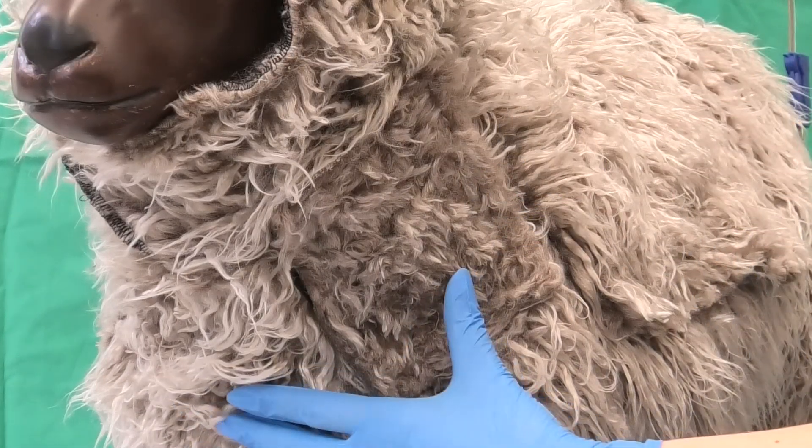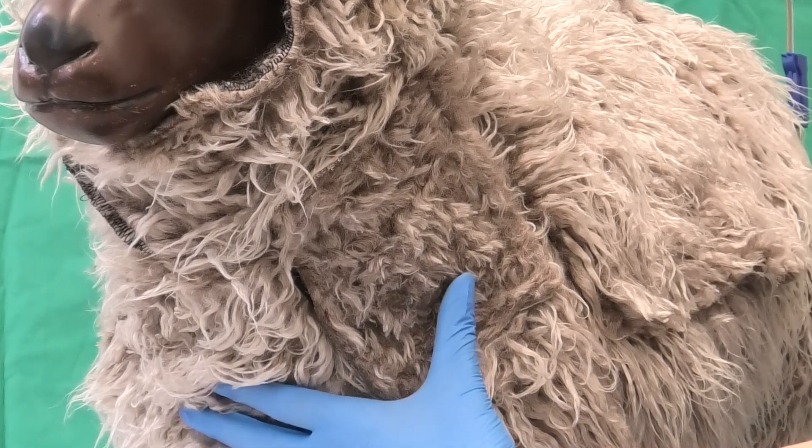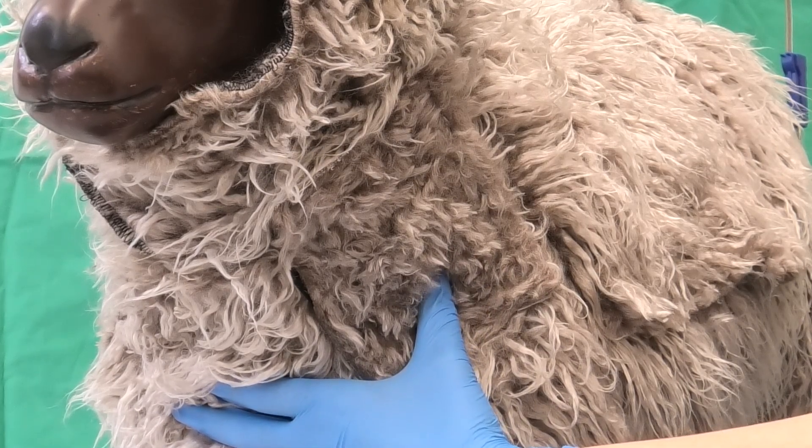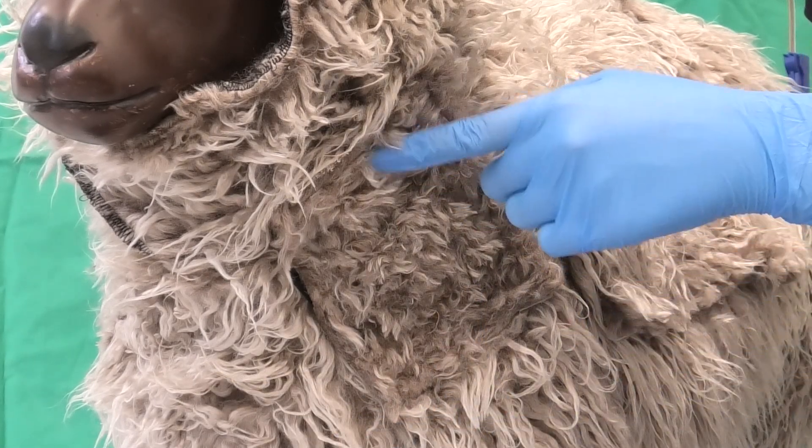With heavily woolen animals, it is recommended to congest and spontaneously relax the vein multiple times. Through this, the wool parts and falls in on itself, allowing for a clear view of the vein. Alternatively, the wool in this area can be shorn.